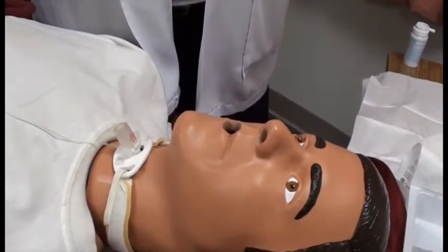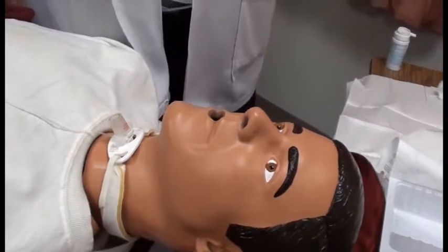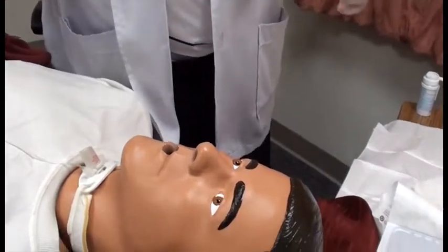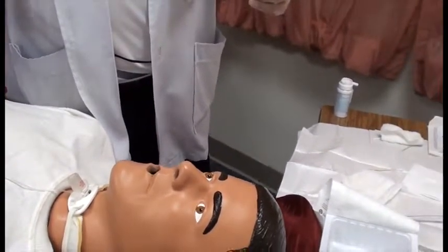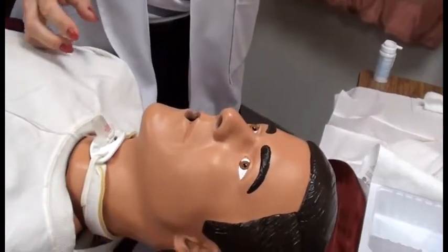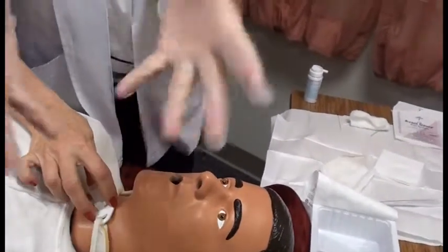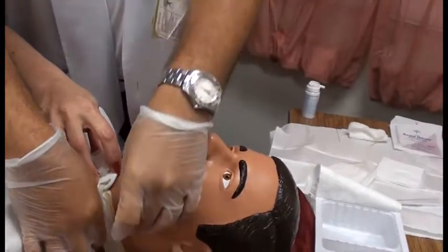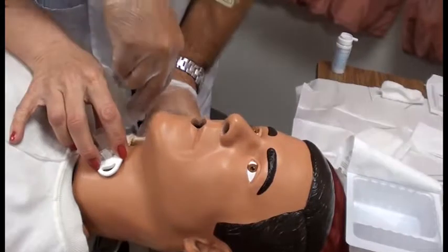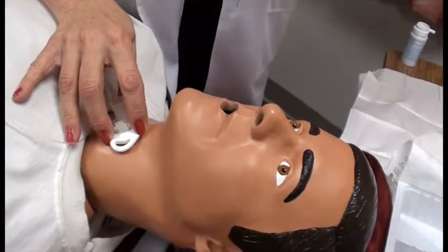And as I said, I don't encourage this with all you nurses, but in my particular case, I was fortunate enough to be born with a third arm. So what I do is I secure the trach tie, or tracheostomy itself, with my third hand. As you can see, make sure that that thing is secure there. Now I can use my other two hands to slowly and gently remove the existing tracheostomy tie. Okay, remove it on both sides, like so. And we now remove this.